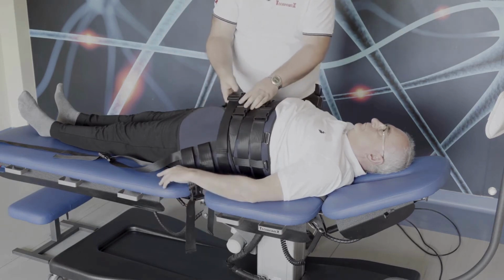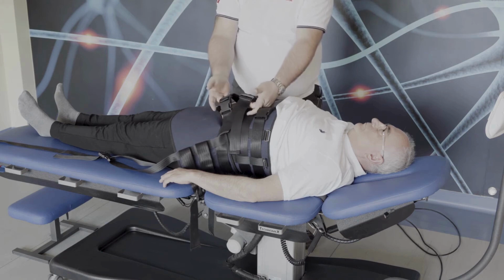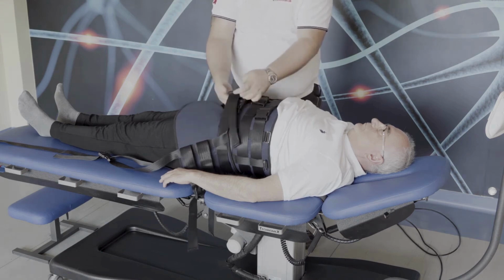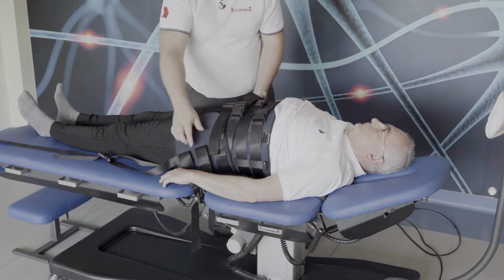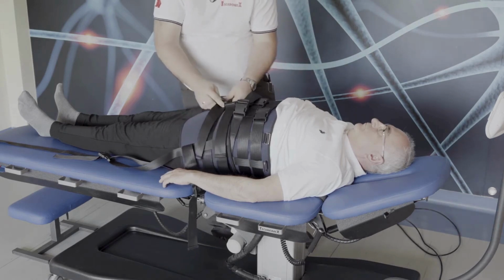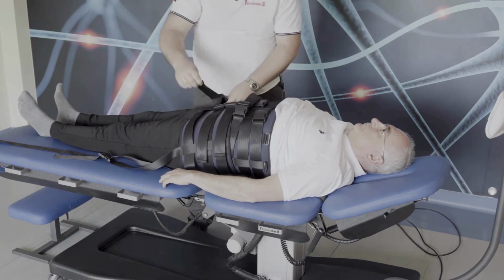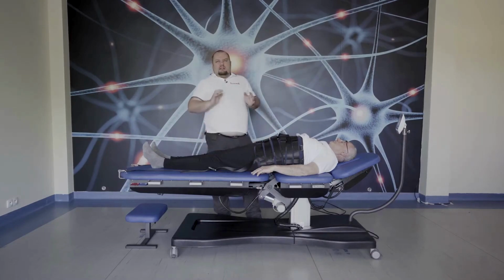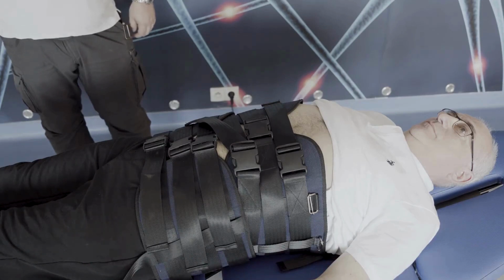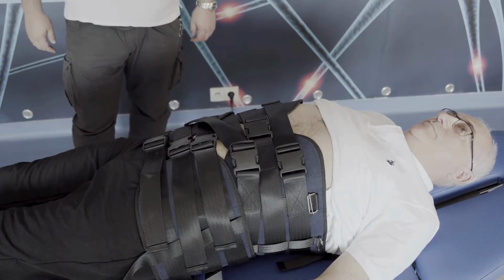It's not a problem if the strips are not crossed. This way is the problem. If they are not crossed, it's okay. Also, the lowest strip of the lumbar belt may not be tight if there is a problem with the hips. 2 of them will be enough.